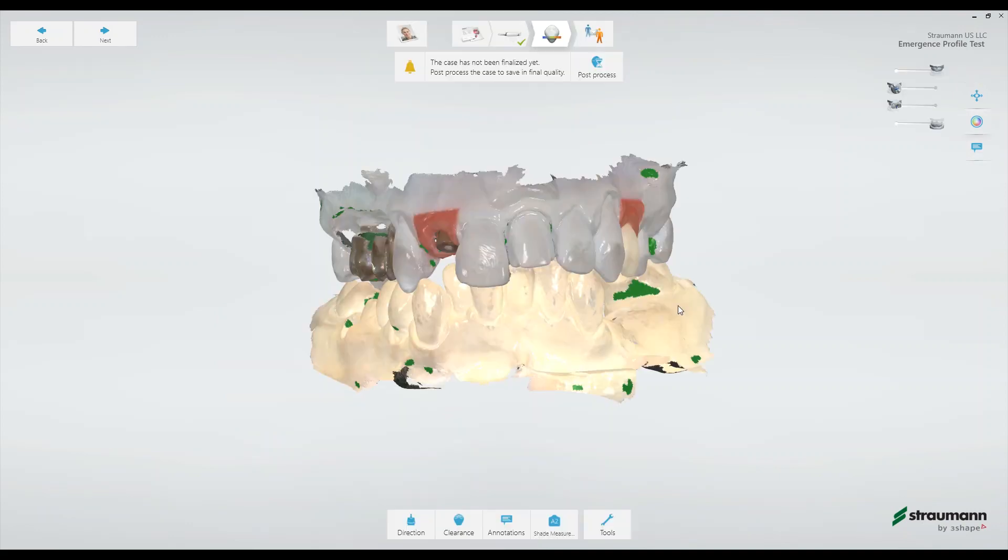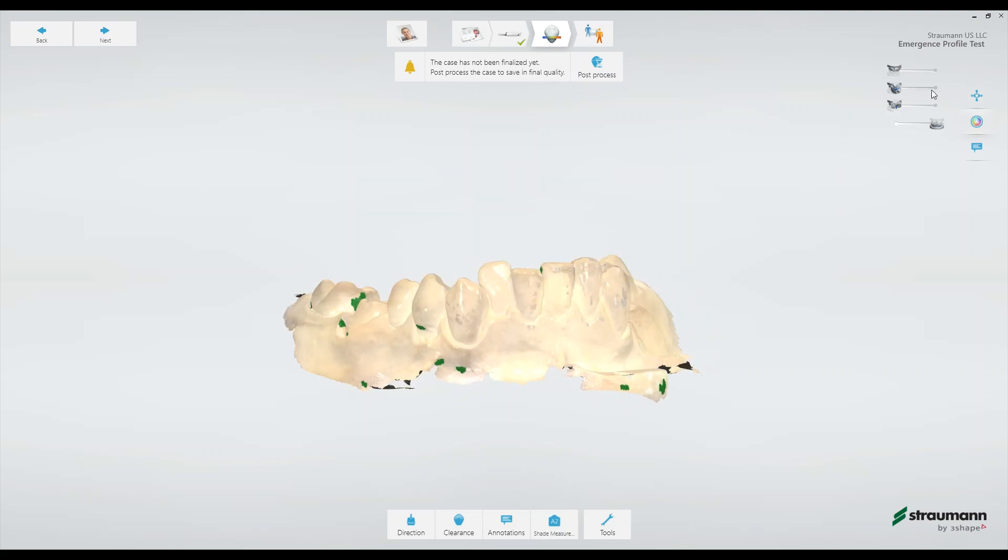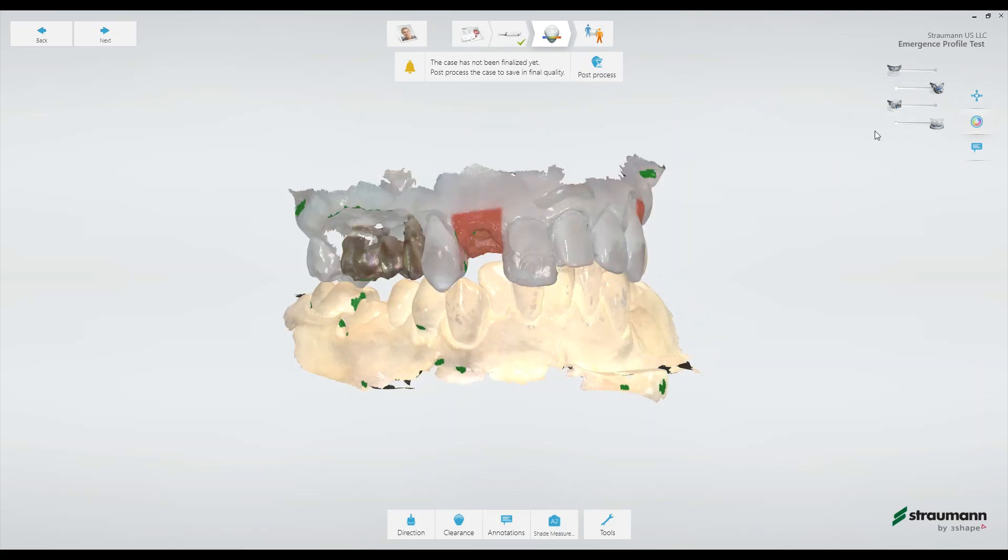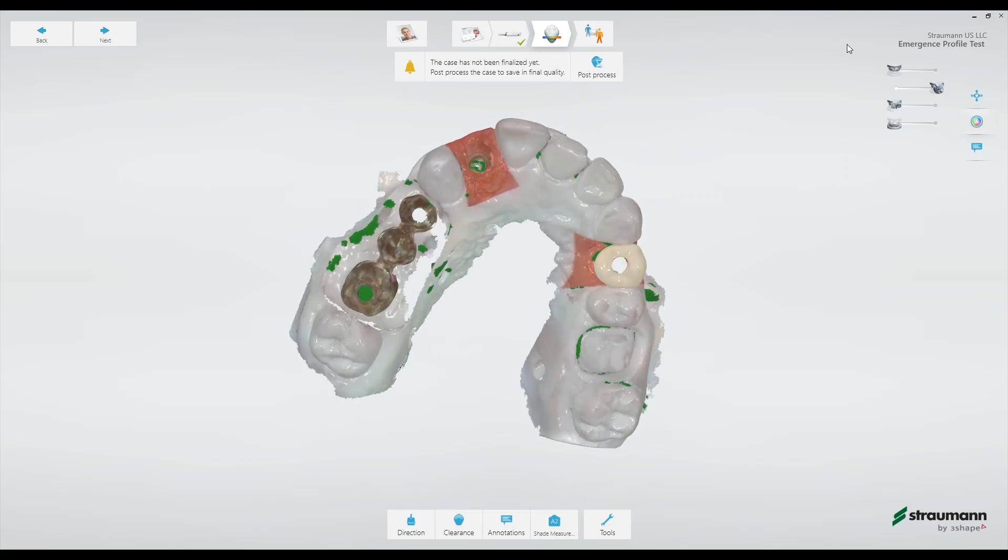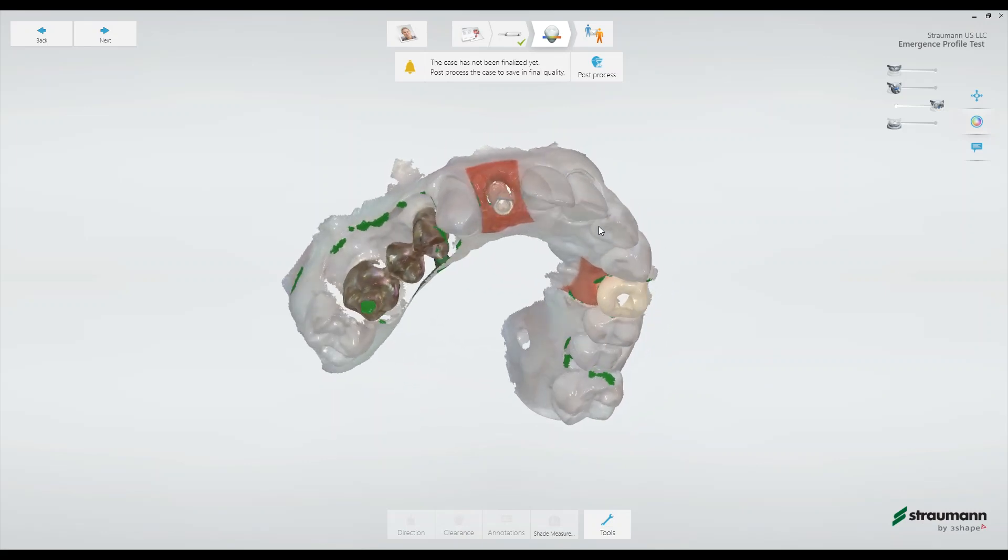At this point we've captured the lower arch, the upper arch with the healing abutment in, the upper arch emergence profile, and the upper arch with the scan body scan.